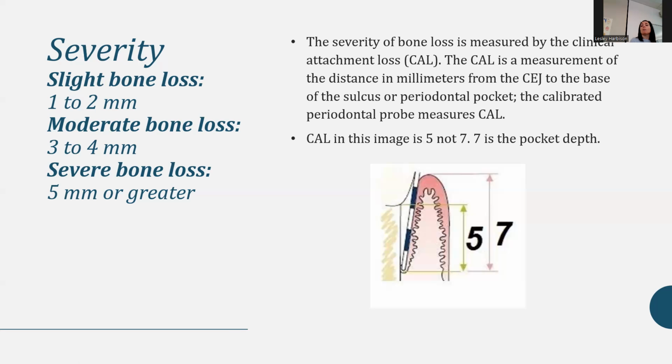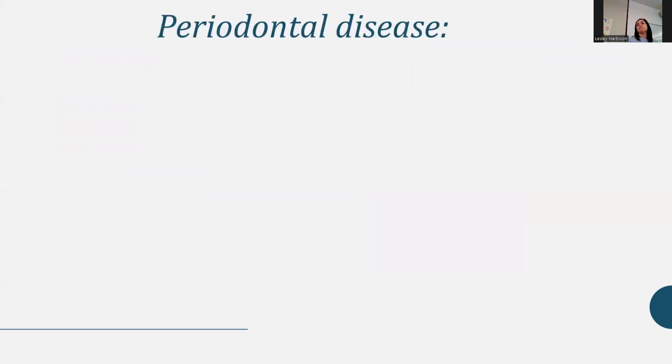And then if you probe the periodontal pocket and take a measurement of 7 from the top of the gingiva, that's a different number. Not relevant really at all to this class, so don't even worry about it. That's just in there because it's part of the whole grading and staging, but you'll learn more about it and be able to differentiate and talk more about that with Mickey.